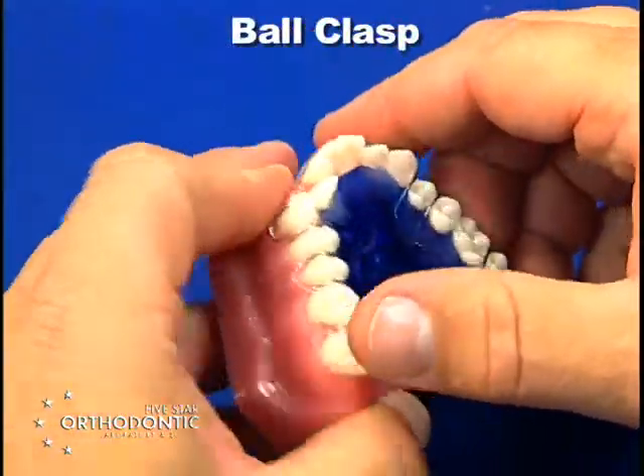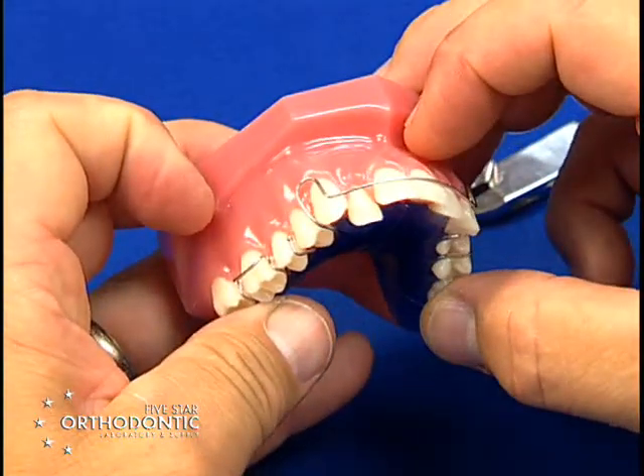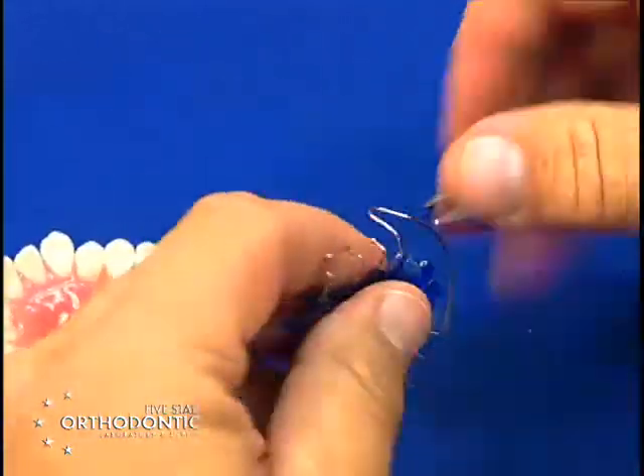Many times when you have a ball clasp, the ball clasp will come up occlusally and away from the tissue, such as this clasp has. Ball clasp is very simple to adjust.